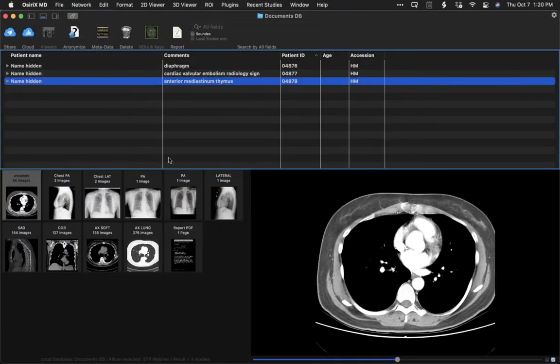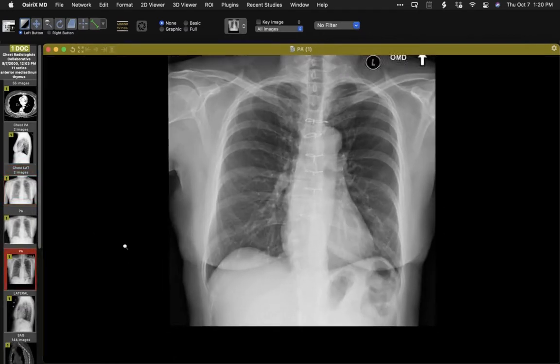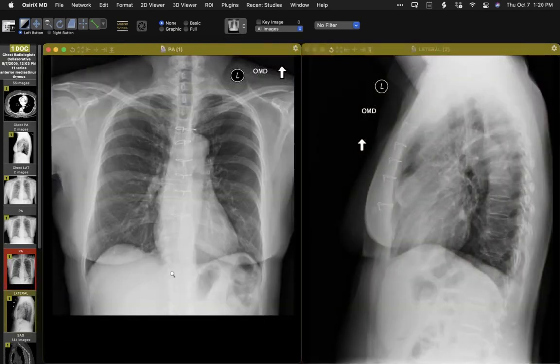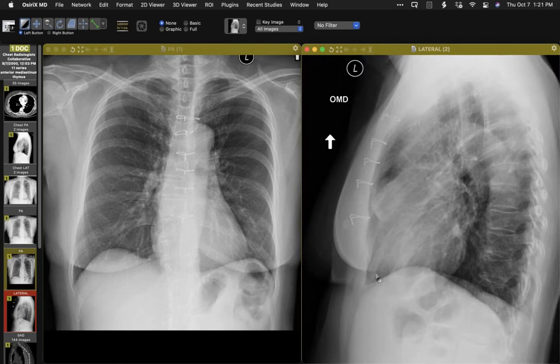And this one is an interesting presentation. So I read a chest radiograph on this person for a cough, a clinic patient, and I'll put up the lateral alongside it. I'll give you a moment just to look at it to see what you see. Bit of an eye test. Not findings that are associated with a cough as such, but an abnormal opacity, particularly well seen on two projections. So really subtle here, and we see it here.